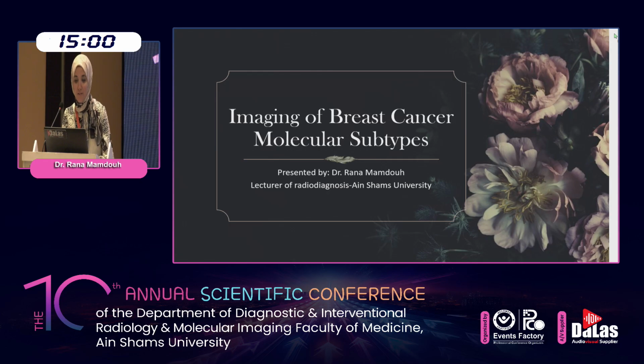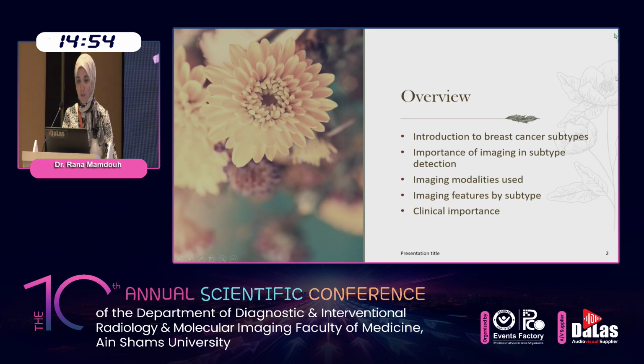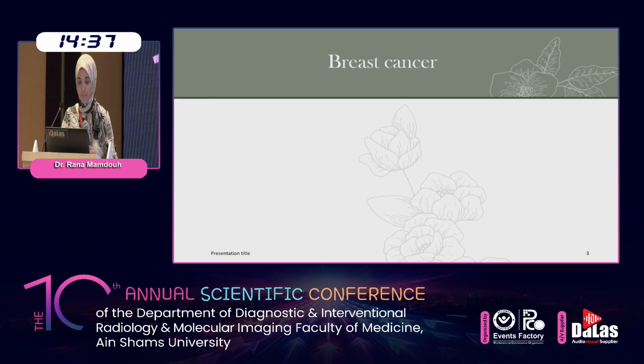Good afternoon, dear professors and colleagues. I will talk briefly about the imaging of breast cancer molecular subtypes. By the end of this lecture, we will know the introduction of breast cancer subtypes and the importance of imaging in subtype detection, imaging modalities used, and imaging features for each subtype and clinical importance.